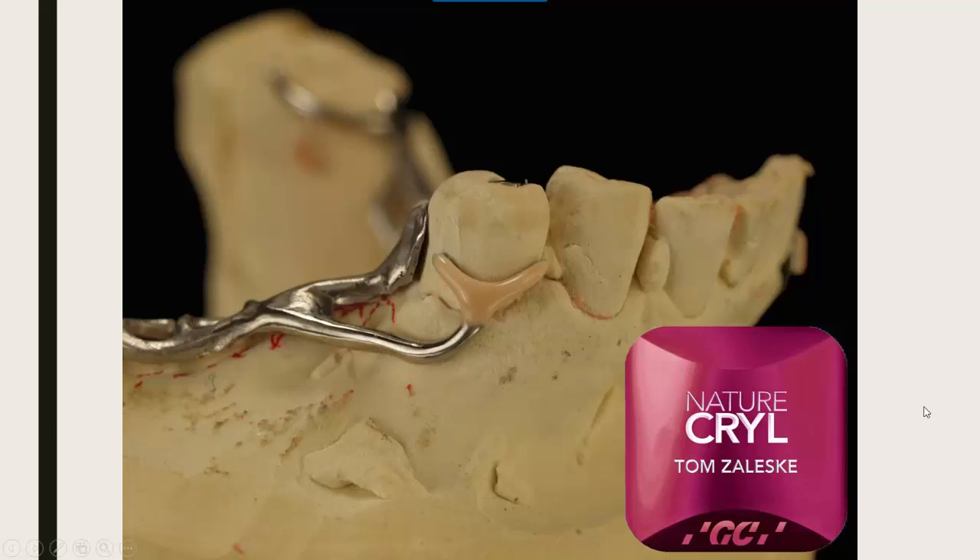Then I started thinking about changing the appearance of clasps in areas where they're going to show — where a patient is going to push back because there's silver in their mouth. I started experimenting with infra-bulge clasps because the flexure happens at the tip; there's no flexure on the body, which seems to be the way to go because we don't want it flaking off.